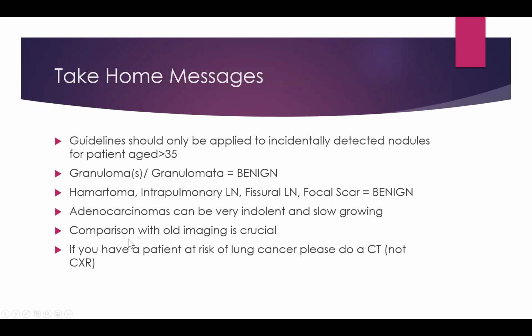If we have older imaging, if you know the patient has had imaging elsewhere a long time ago, it's very crucial that we get it, because then we can sometimes get away without following up if something's been stable for a long time. And this is maybe not very relevant, but if you're worried a patient has got cancer, if they're heavy smokers, they've got a strong family history, don't do a chest x-ray, just go to a CT. Small cancers can be missed on chest x-ray, but CT is a very good test, and it doesn't involve a lot of radiation, and we can even do it non-contrastively. Don't need to give contrast, and it's very safe.